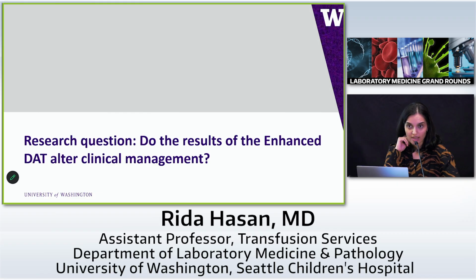And we do get requests. So we've had our LMRs screen enhanced DAT send out tests for the last few years, and these do come up very frequently. And the first question we always want to ask, did they even have an in-house DAT? Because sometimes the answer is no, they haven't.